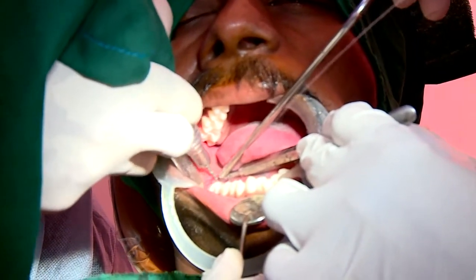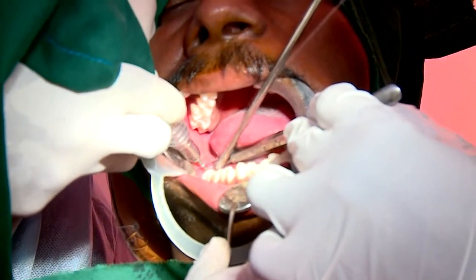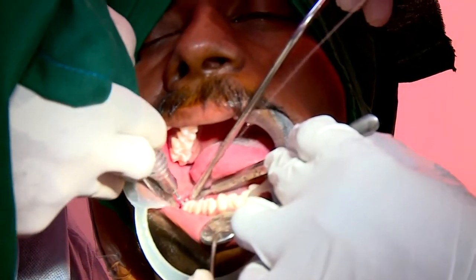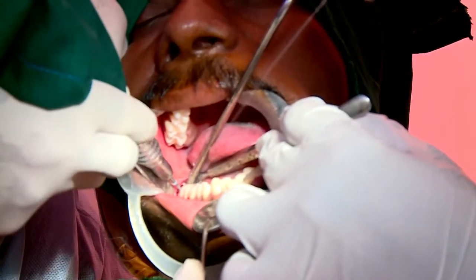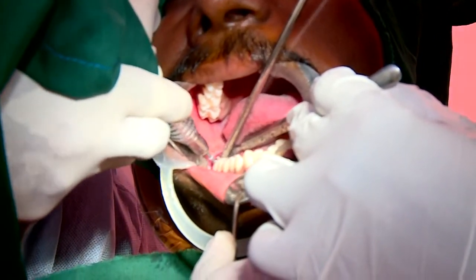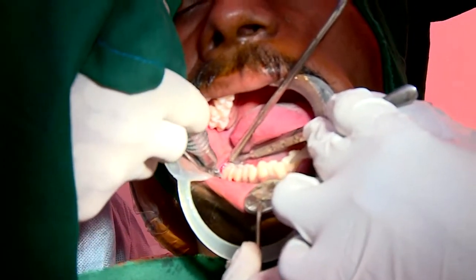Can you see the split now? Yes, now it's clearly visible how sir is doing it. Usually we can leave the lingual portion. Lingual enamel can be left, so you do not do a full cut on the crown. You can leave a small lingual fragment and break it with the elevator. I think sir will show that also.